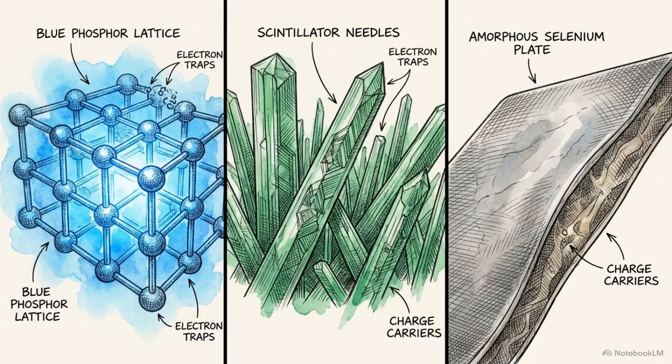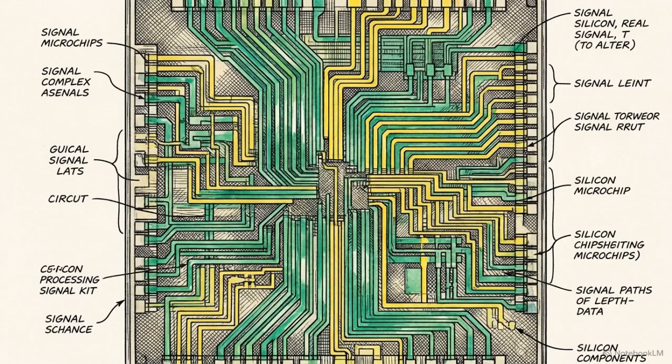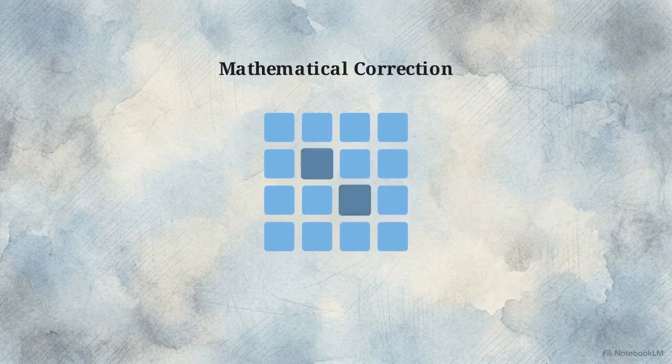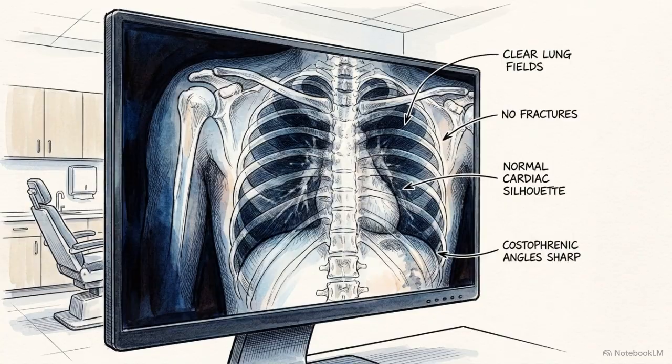The capture of a radiograph requires transient high-energy photons to be trapped through phosphorescence, optical scintillation, or direct electrical charge conversion. Once that physical energy is held in place, it is systematically routed through precise solid-state architecture, pulled through an analog-to-digital converter, and mathematically corrected into a functional array. Modern digital radiography replaces the chemical darkroom with crystalline traps, active matrices, and algorithmic processing to make the invisible permanent.